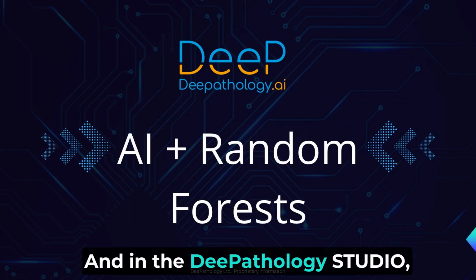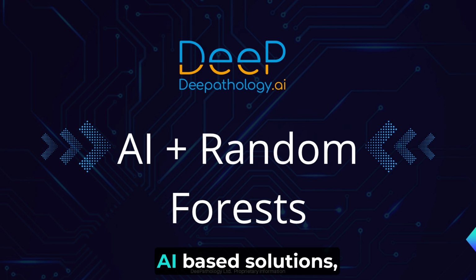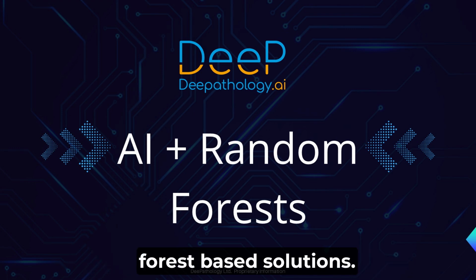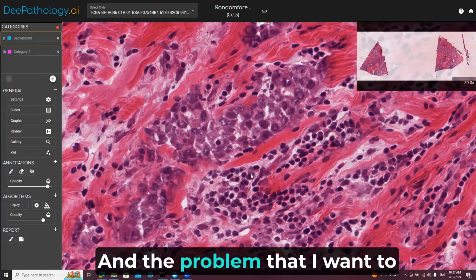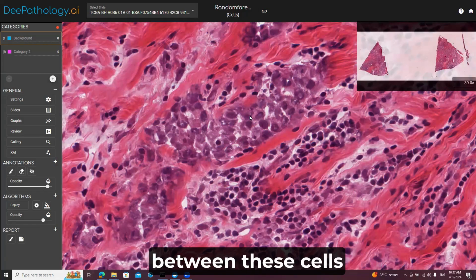And in the DeePathology STUDIO, not only can you develop AI-based solutions, but you can also develop random forest-based solutions. Let me show you how it's done. So this is a TCGA slide, and the problem that I want to solve is to differentiate between these cells and these cells.